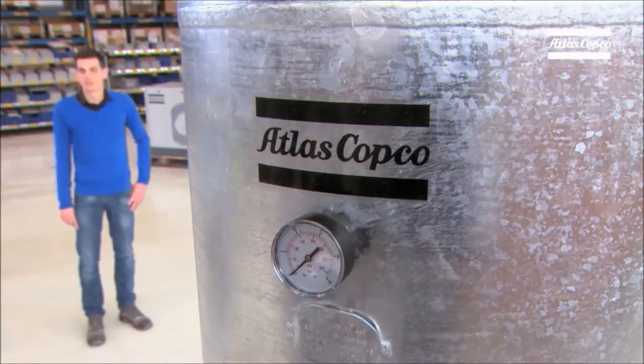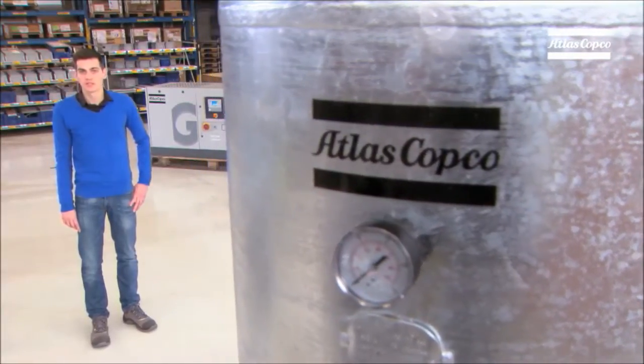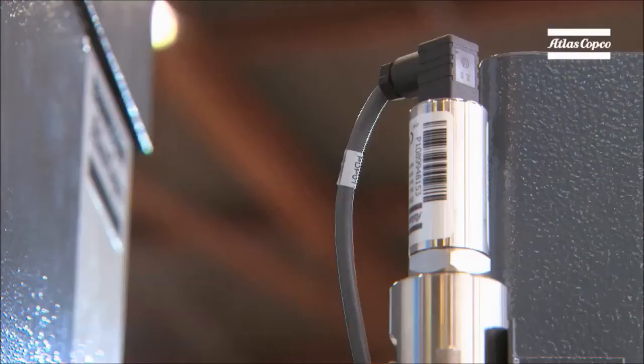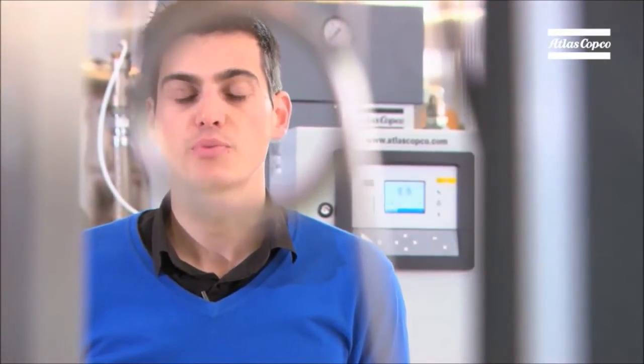Sustainable productivity is Atlas Copco's baseline, also when it comes to medical solutions. The new medical air plant is very energy efficient, thanks to the use of several smart technologies. The MedPlus is supplied with purge control. This saves up to 70% of compressed air during times of low demand, overnight for example. The good news is that this is a standard feature on our purifiers.